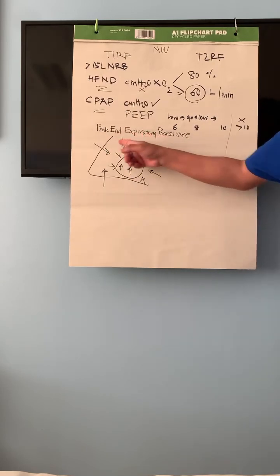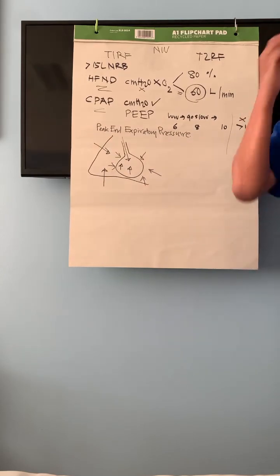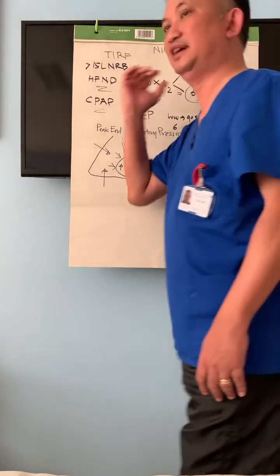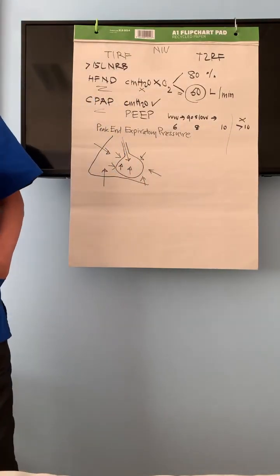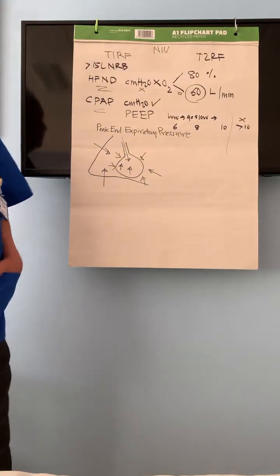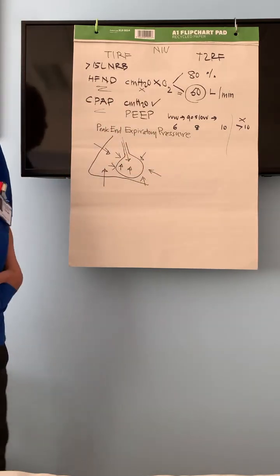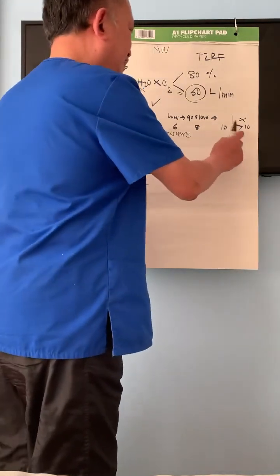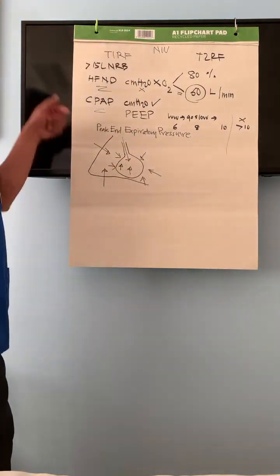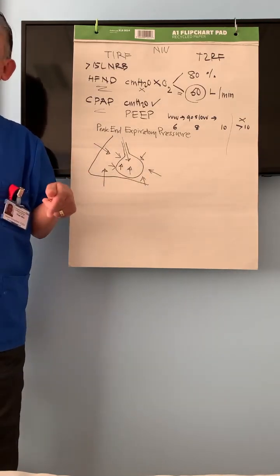At the end of the expiration, CPAP is delivering small PEEP pressure to prevent the total collapse, the atelectasis of the lung, and to prevent the lung injury. So they are ready to reopen again. They are not sticking to each other. So that's why CPAP pressure cannot be too much. If you deliver too much, you are also tearing the injured alveolus.